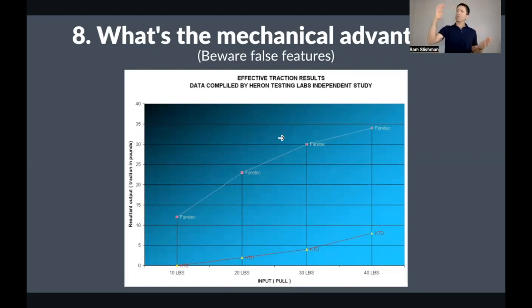But you do a, wait a minute, I took high school physics. What's happening here? I think what you see is just how much goes into friction. So 4-to-1, it should be quite a bit more. I mean, you should get 160 pounds of output force. In any case, a lot of the pull goes to friction.